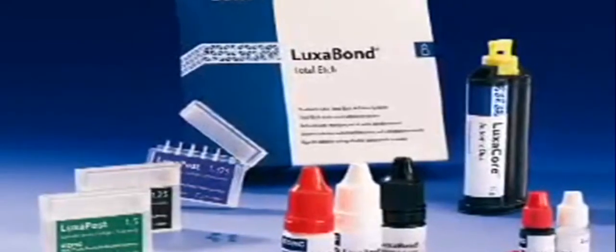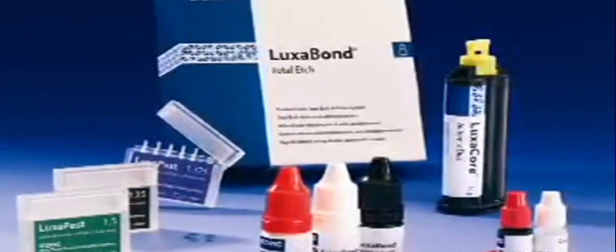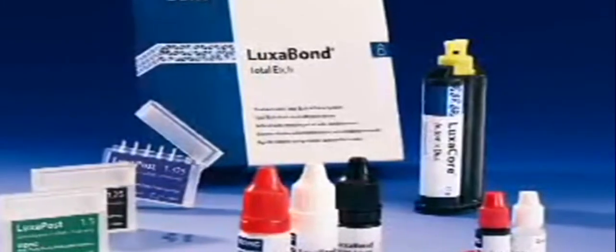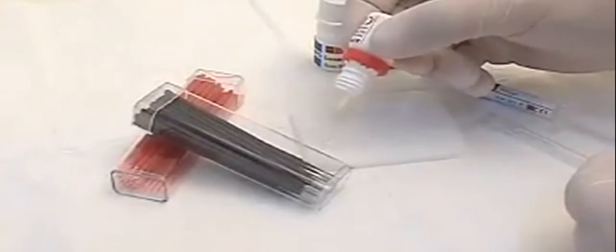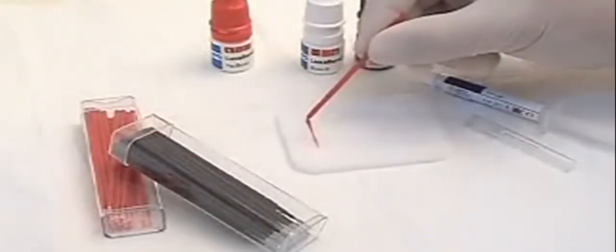Once proper isolation is achieved, we shall apply bond in the canal space, air dry for 15 seconds and then cure the bond. We will use Luxa Bond Total Etch, which is a dual curing adhesive system that comes with a pre-bond and a bond A and bond B. Apply 1 to 2 drops of pre-bond on the etched tooth surface for 20 seconds.